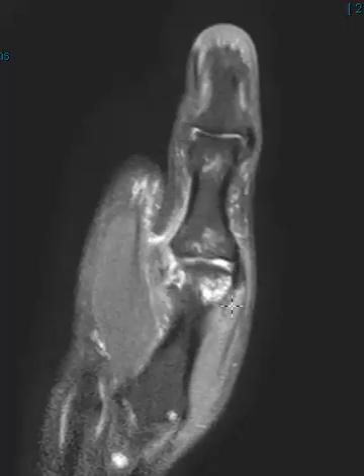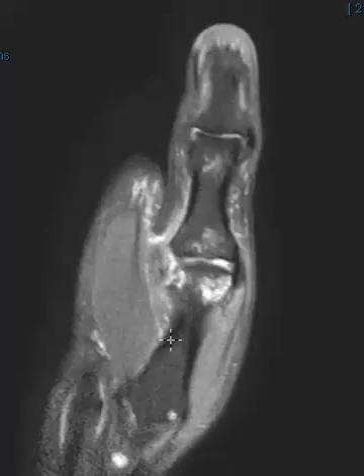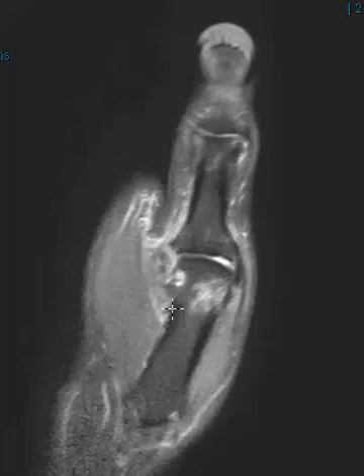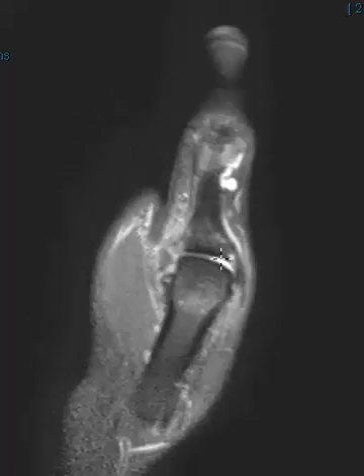The radial collateral ligament looks just about right — a nice dark band there. The ulnar collateral ligament — a lot of times these are really hard to tell, but luckily this one is not too hard. You can see it is not normal at all; it looks completely torn and ruptured. We see a little area of brightness where there's a defect in the cortex, a little avulsion fracture. It's completely ruptured — the UCL should attach to the metacarpal head and also to the base of the proximal phalanx.